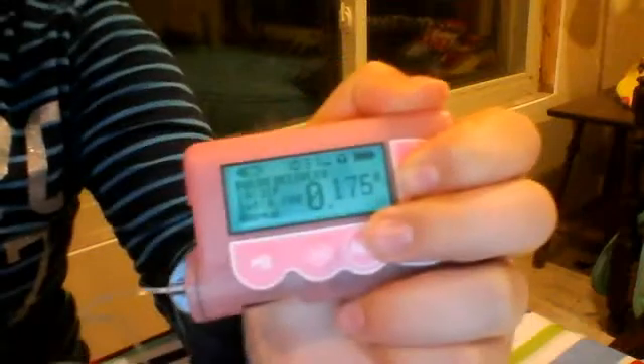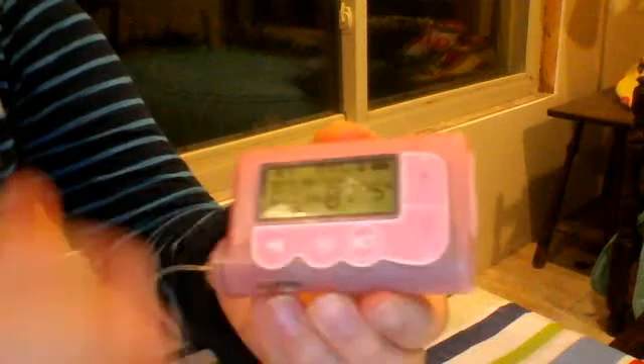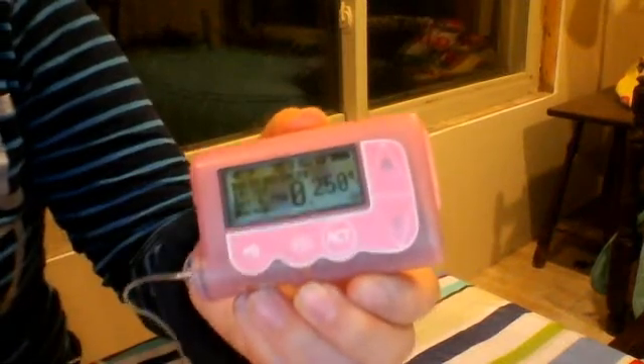So that is how to bolus using the bolus wizard from the home screen. My name is Gabriela and I am Feeding Type 1.